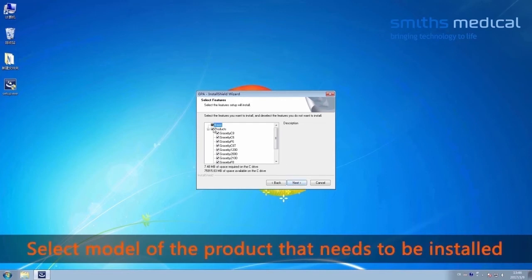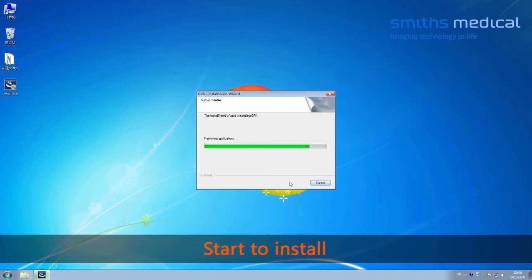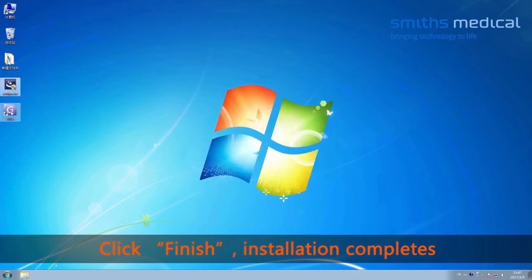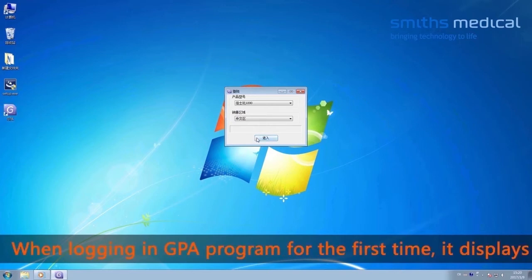Select the model of the product that needs to be installed. Click Next, then click Install to begin installation. Click Finish when complete. Installation is complete. Double-click the GPA program to enter the logo screen. When logging into the GPA program for the first time, it displays in Chinese.